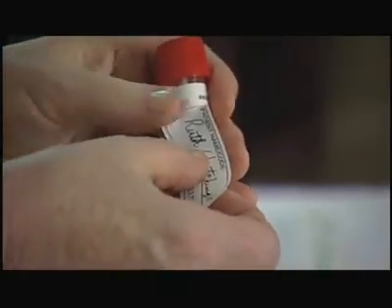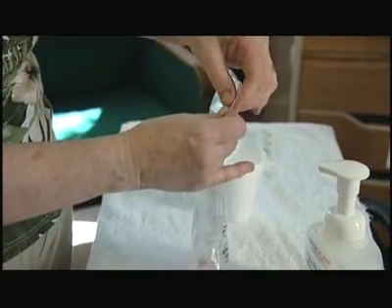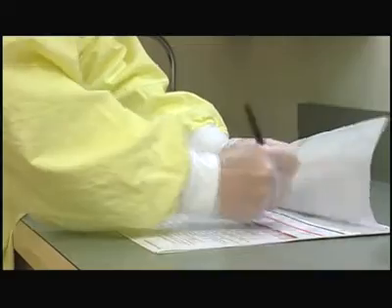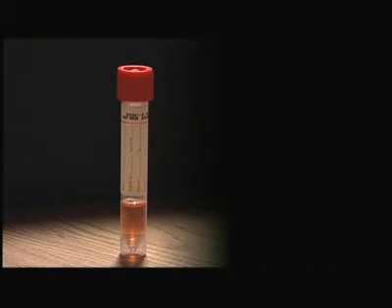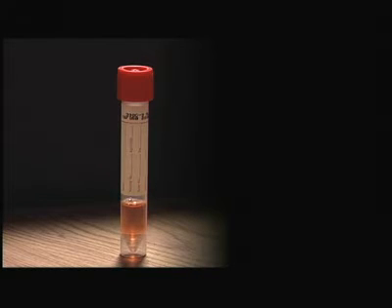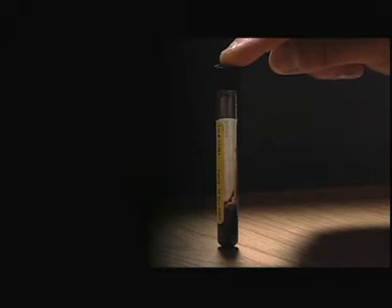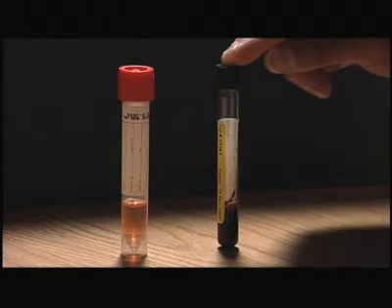Once you've collected the sample, ensure that you've labeled the sample device with at least two patient identifiers, specifically the patient name and either the personal healthcare number or date of birth. In addition, please include the specimen source, such as nasopharyngeal or throat swab. The collection tubes should be labeled either prior to or immediately after collecting the sample so that you avoid patient mix-ups and incorrect labeling, especially when collecting multiple samples from the same or different patients. If you're collecting a nasopharyngeal sample for respiratory viruses, send it in the universal transport medium. However, if it is for Bordetella pertussis, send it in the Reagan Low or equivalent transport medium. Please do not mix the two, as the viability of the bacteria or viruses will be adversely compromised and the sample will not be accepted.